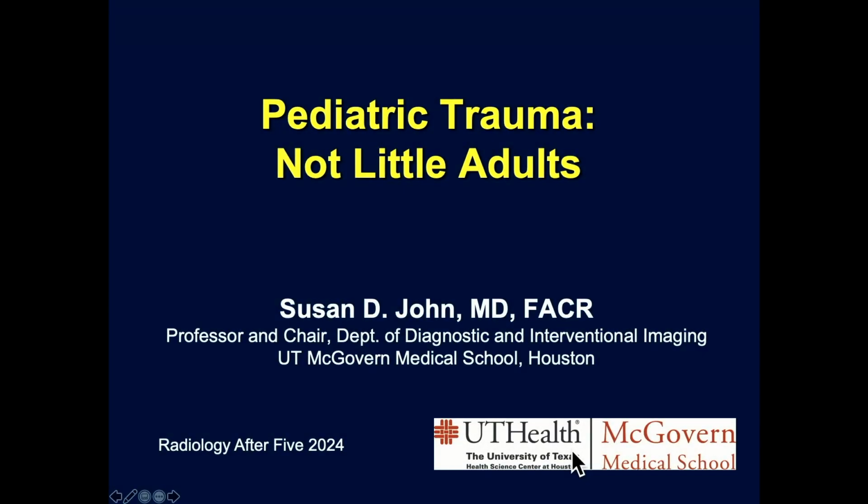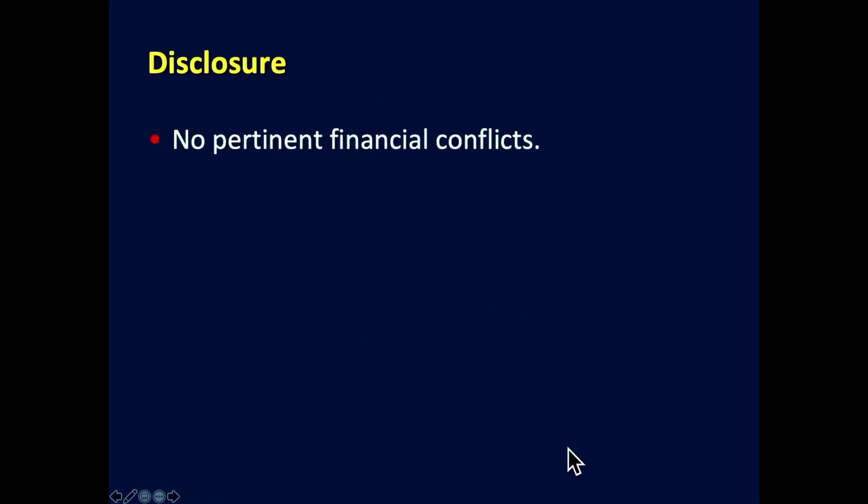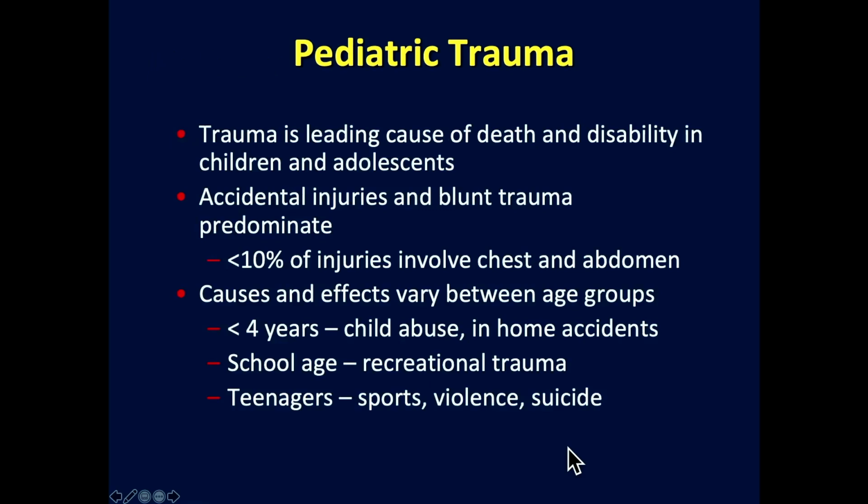So the famous statement, children are not little adults, holds really true in trauma. Pediatric trauma is a pretty large topic, and so I'm going to try to focus on those aspects of imaging trauma in children that are a little bit different than what we do in adults.